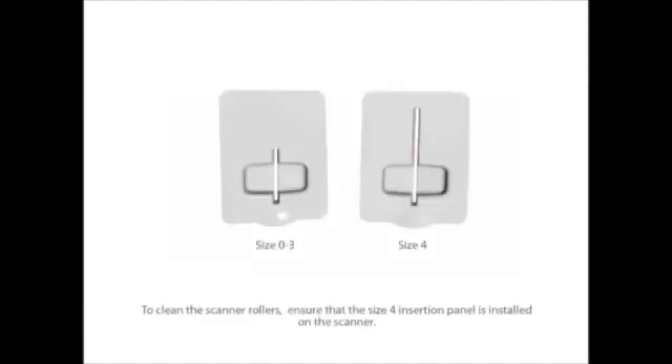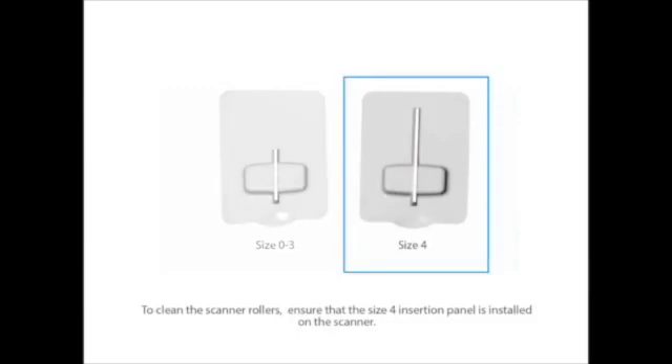To clean the scanner rollers, begin by ensuring that the size 4 insertion panel is installed on the scanner. For directions on how to remove and replace the insertion panel, view the optional video at the beginning of this objective.